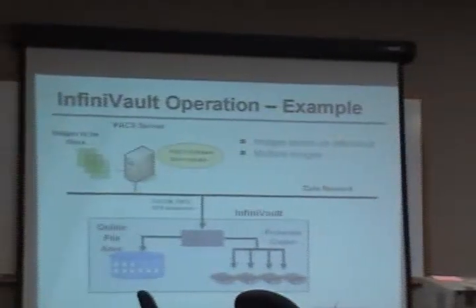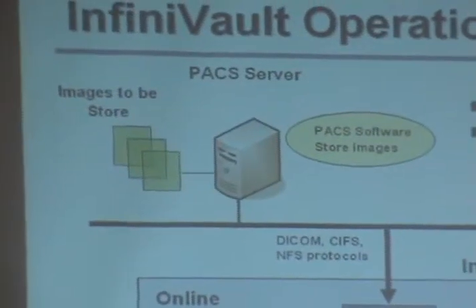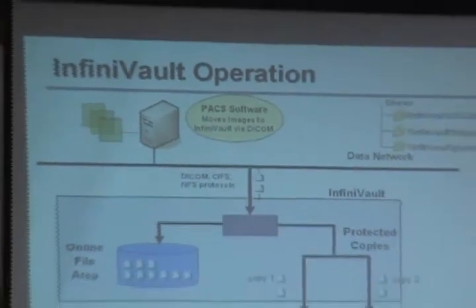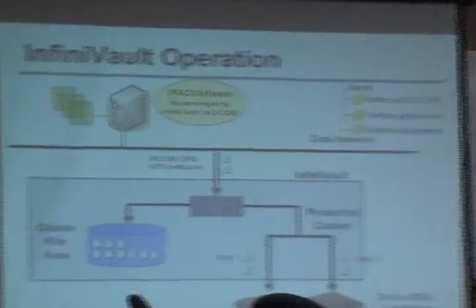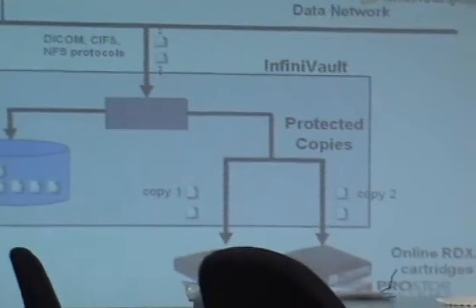Okay. So basically, PACS images are ingested the same as any other of the images that I already went through in the presentation. Again, adding now the DICOM protocol in addition to NFS or CIFS.